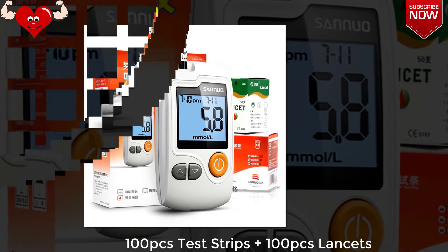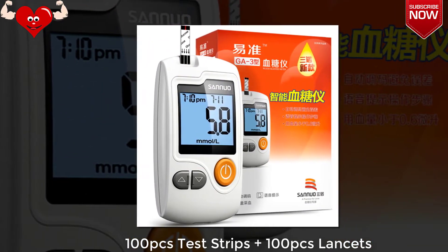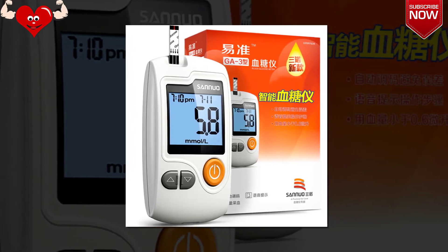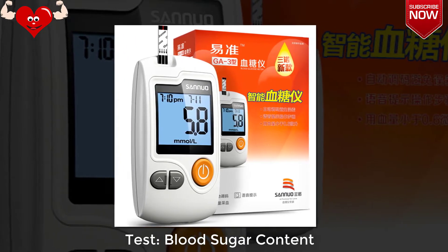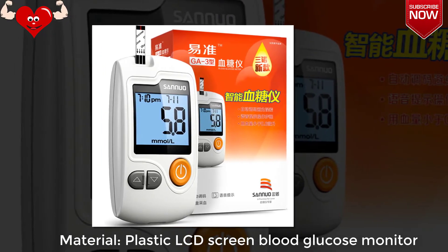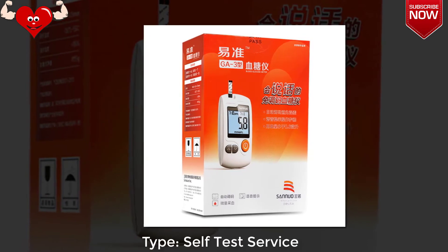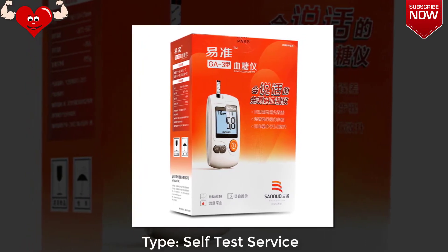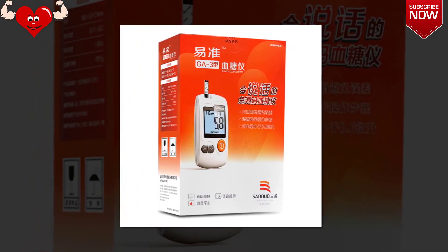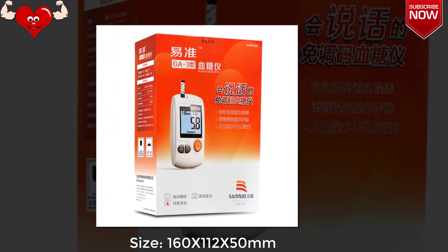100 pcs test strips plus 100 pcs lancets, tests blood sugar content. Material: plastic, LCD screen blood glucose monitor. Type: self-test. Size: 160 by 112 by 15mm.